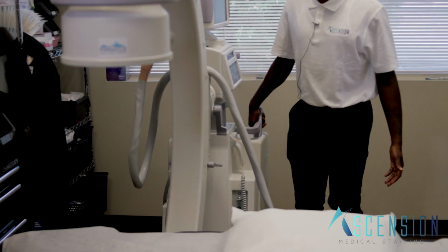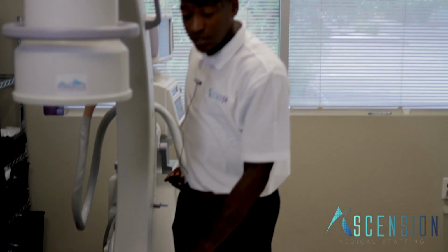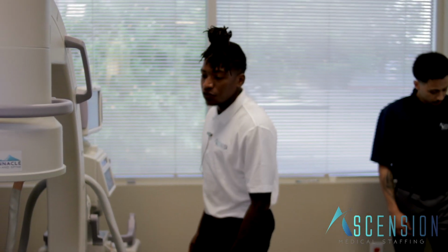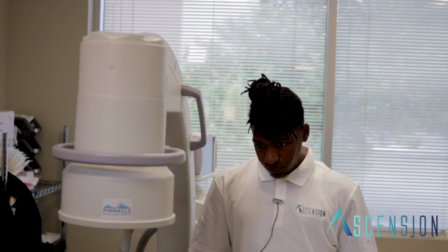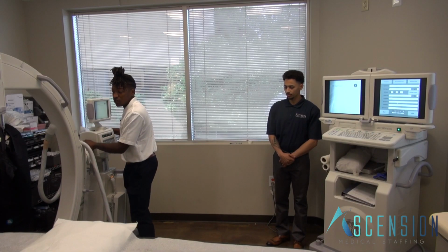Now for our procedure, which is a cervical SNRB, that's a procedure where we're looking at the cervical spine, the patient's neck, and trying to relieve pain that's going down from neck to hand. For that procedure, you have a patient lying straight up like so, which is the PA position. So you would have the patient lying face up, and then you want to line up your C-arm above the patient.